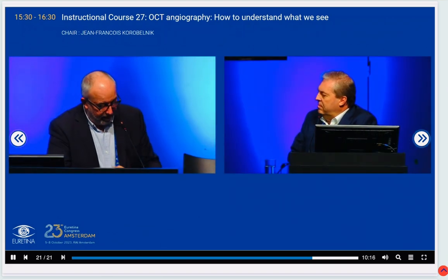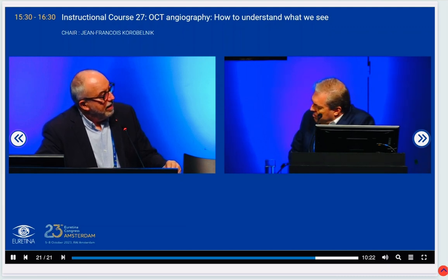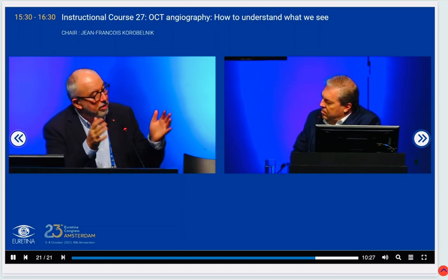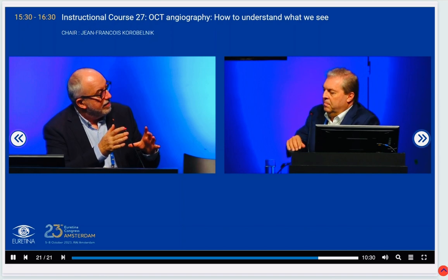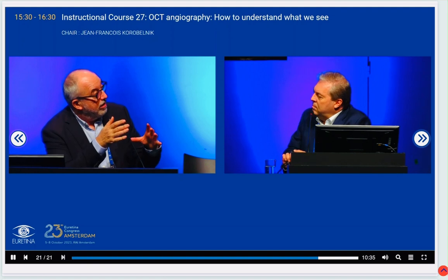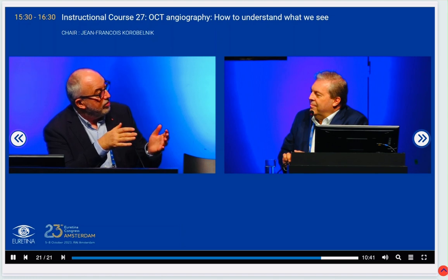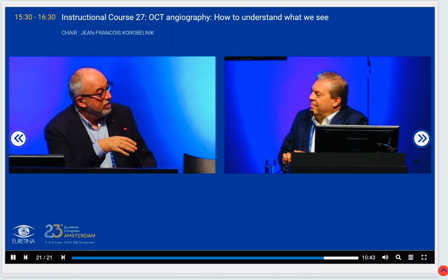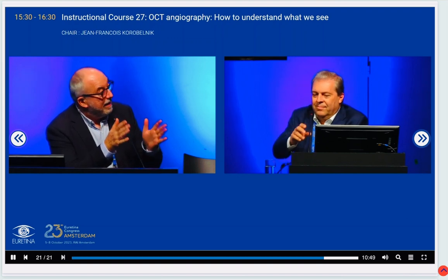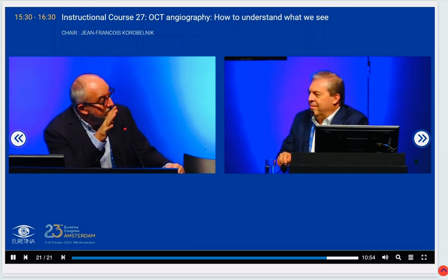Thank you very much, with very nice images. I have just one question about the wide field, because obviously diabetic retinopathy expands beyond the usual 3x3 or 6x6 square that we do. To have wide field images, you need to do a montage, or you need more time at the acquisition. And some machines are doing 8x8, 11x11 now, maybe more. How often do you do wide field as compared to, let's say, the 6x6 in diabetic retinopathy cases? Do you think it's necessary, or it's just on demand?